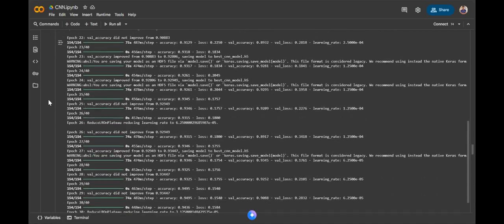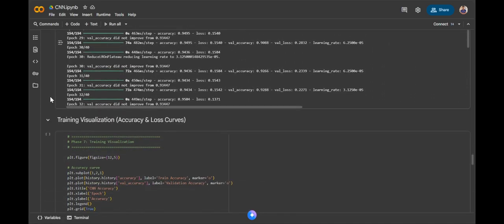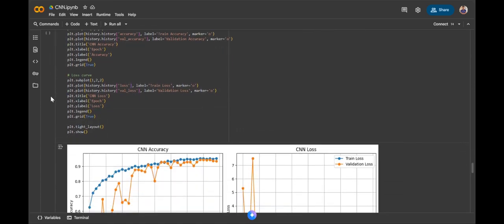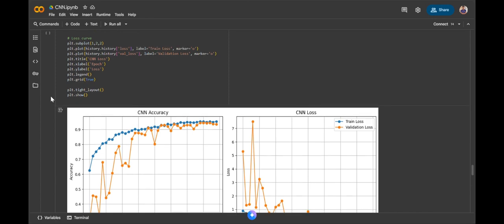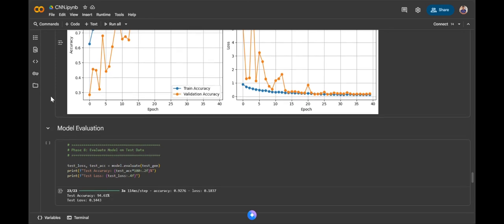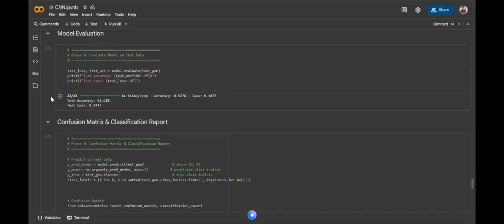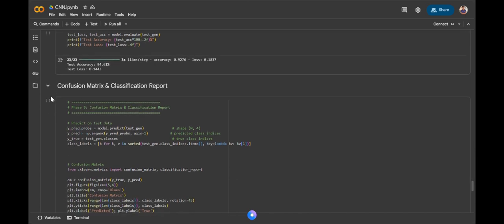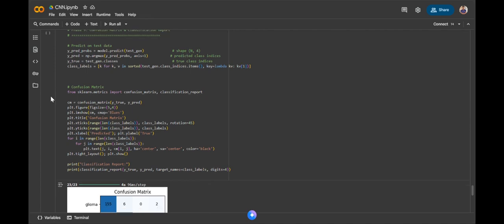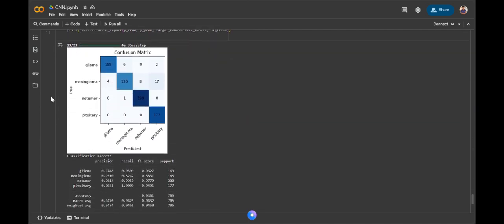The main objective of our project was not just to classify MRI scans correctly but also to identify which deep learning model performs best for this task. By comparing CNN, VGG19, InceptionV3, and YOLOv11n, we aimed to balance accuracy, speed, and computational efficiency. Our expectation was that transfer learning models like VGG19 and InceptionV3 would outperform the baseline CNN due to their ability to extract more complex and generalized features.